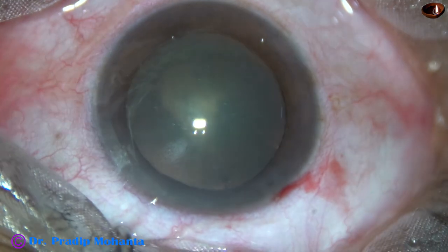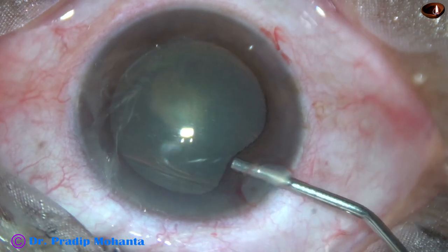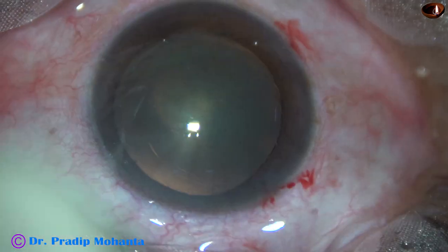By this time, the main incision and a side port has been made on the right side of the main incision. The anterior chamber is filled up with 2% hydroxypropyl methyl cellulose.